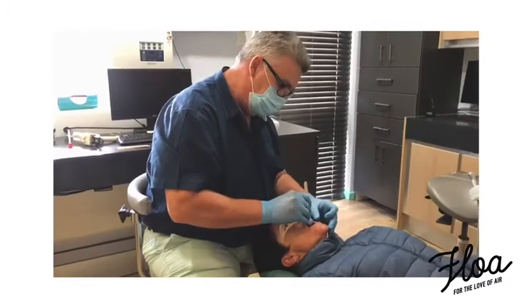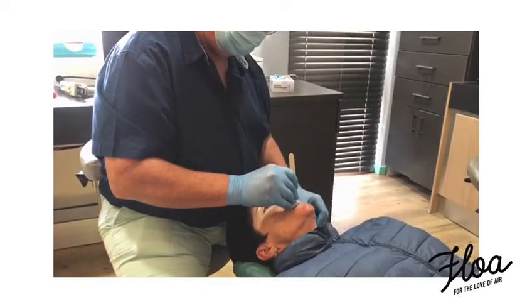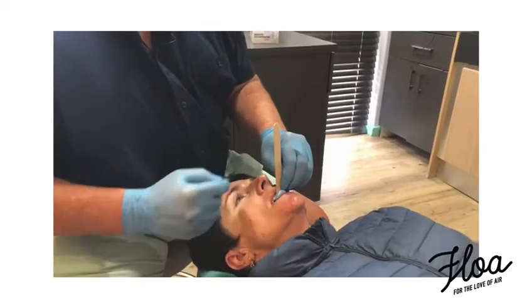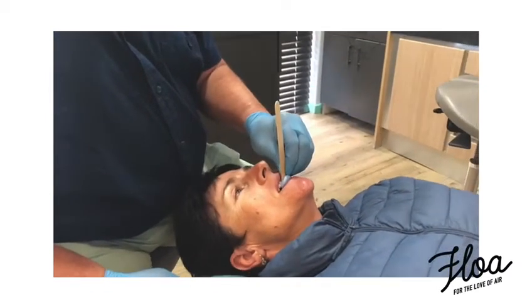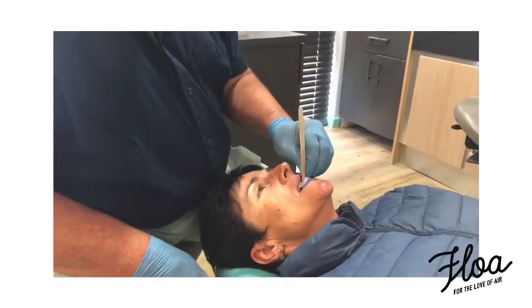Gently bite closed for me all the way through until you feel it, and hold it just like that — just a gentle bite, not hard. The one thing to keep in mind all the time is to try and keep your tongue depressor stick absolutely parallel with your tragus line. It gives you a reference all the time and makes sure that you don't tilt the mandible out into an uncomfortable position for the temporomandibular joint.